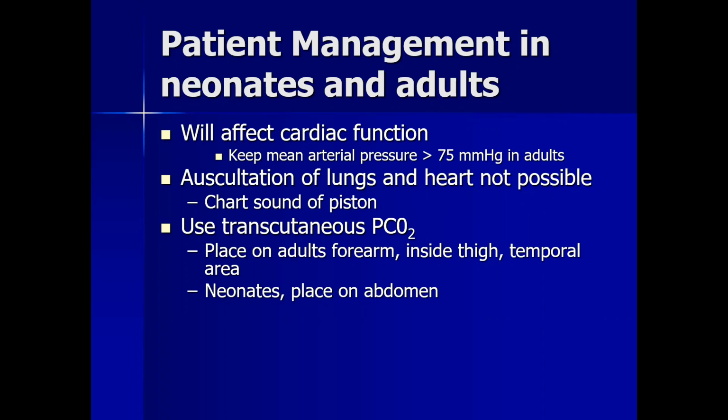Okay, here's something else that's kind of strange. So we're used to hearing air going in and out of the lungs, but when you put your stethoscope on a chest on the oscillator, you don't hear air going in and out of the lungs. You hear do, do, do, do, do. You hear the piston. Well, if there's no pneumothorax, you don't have a right main stem intubation, you don't have a mucus plug, the do, do, do should sound the same on the left and the right. So that's what you're charting. Sound of piston is equal.